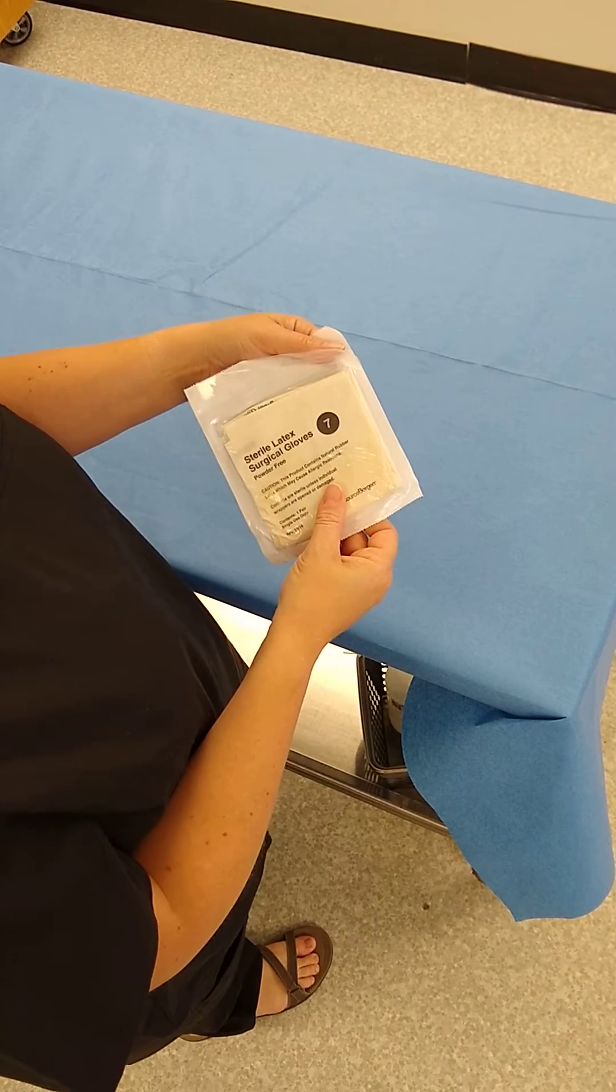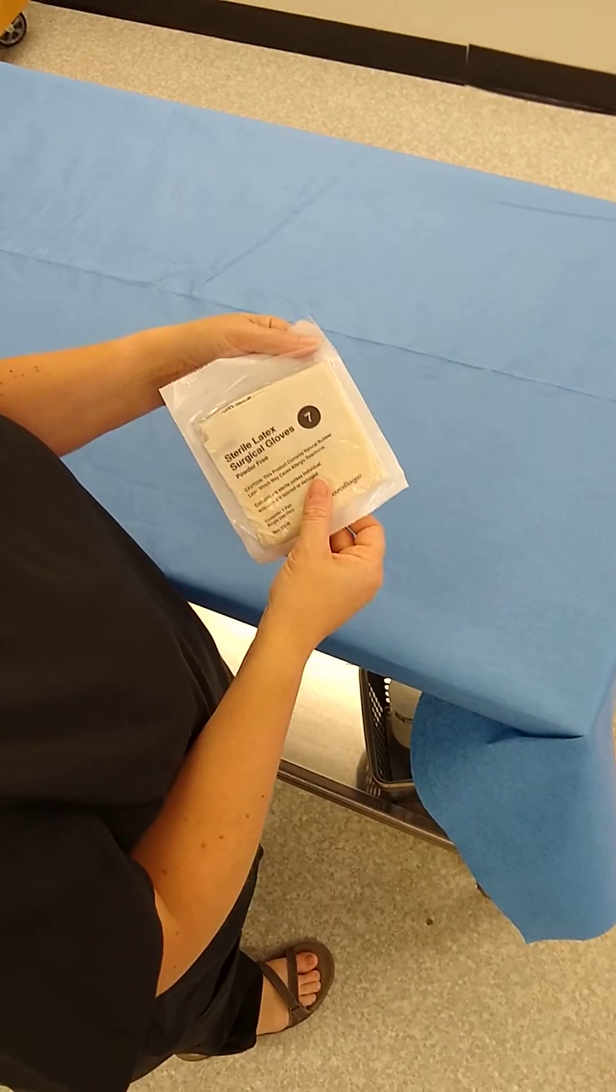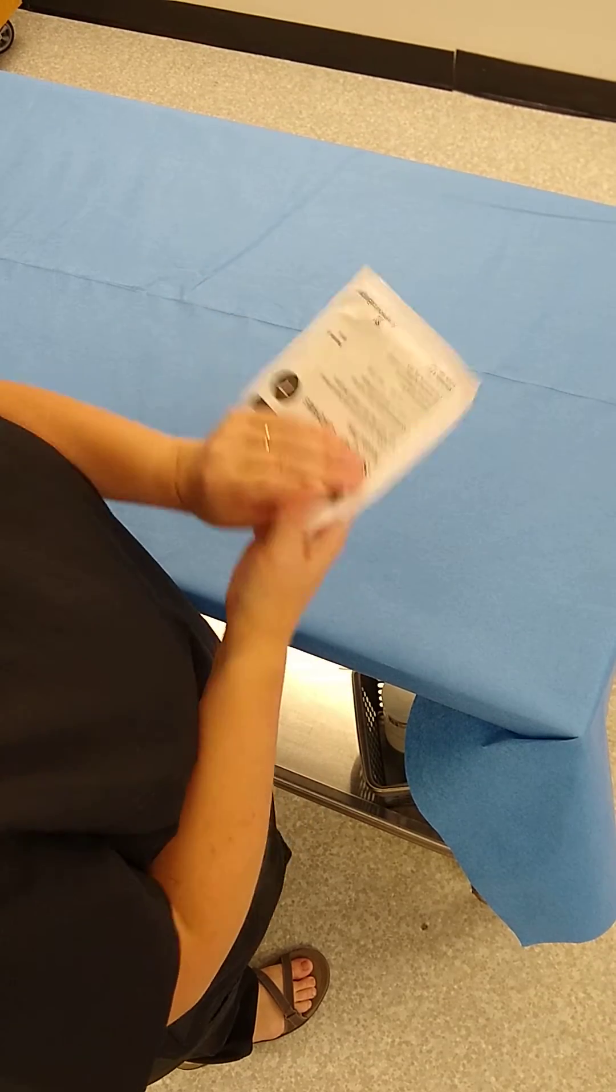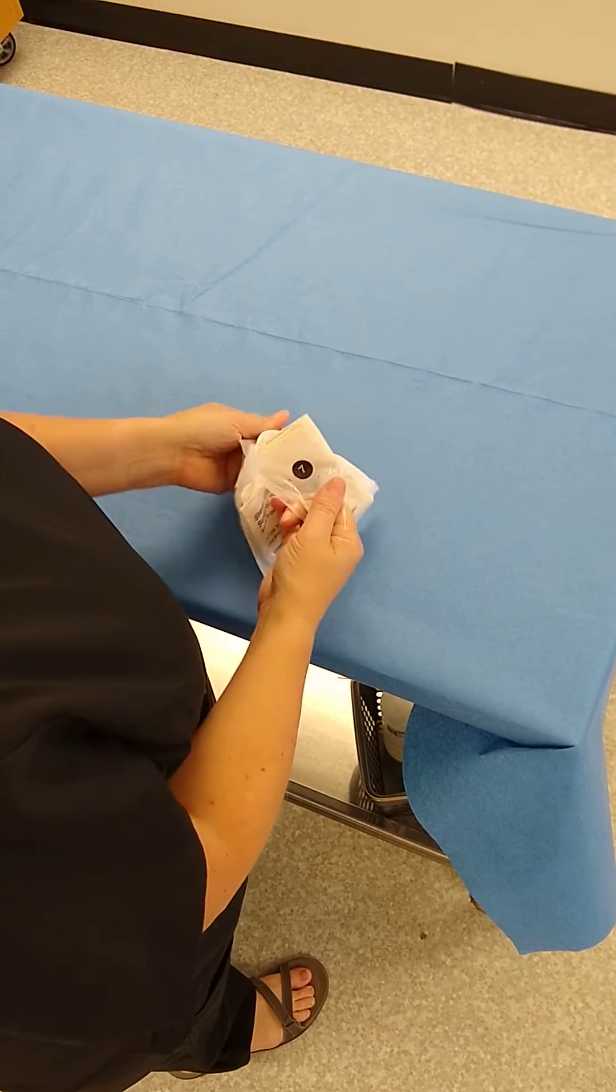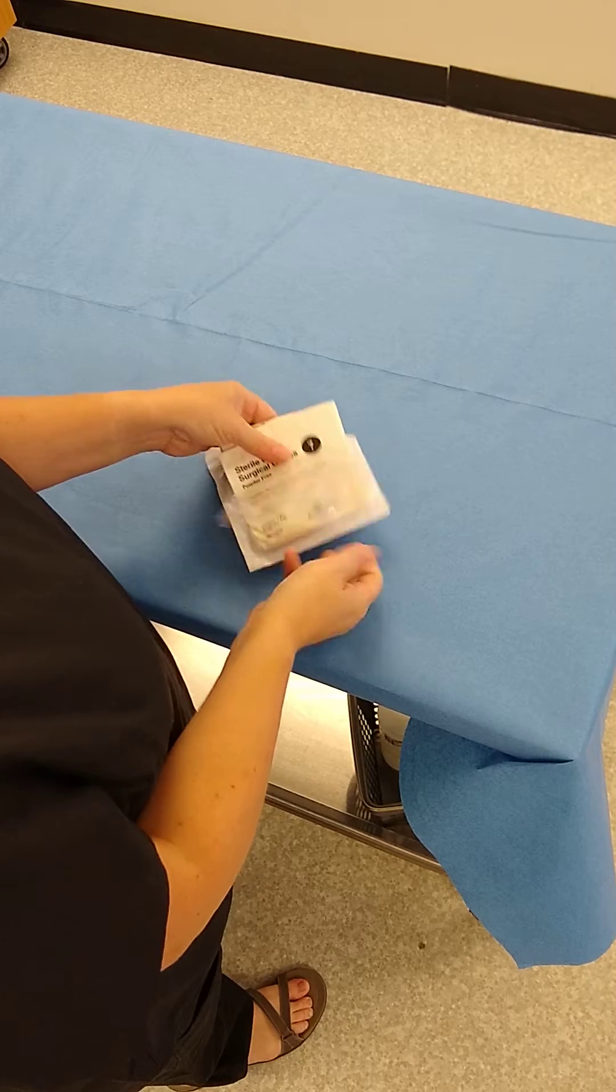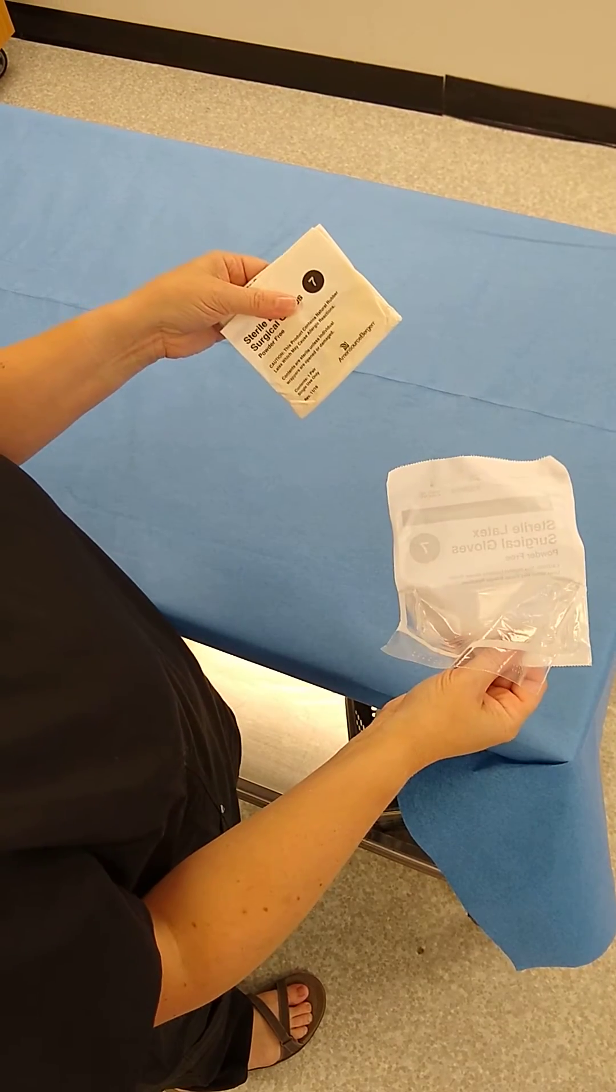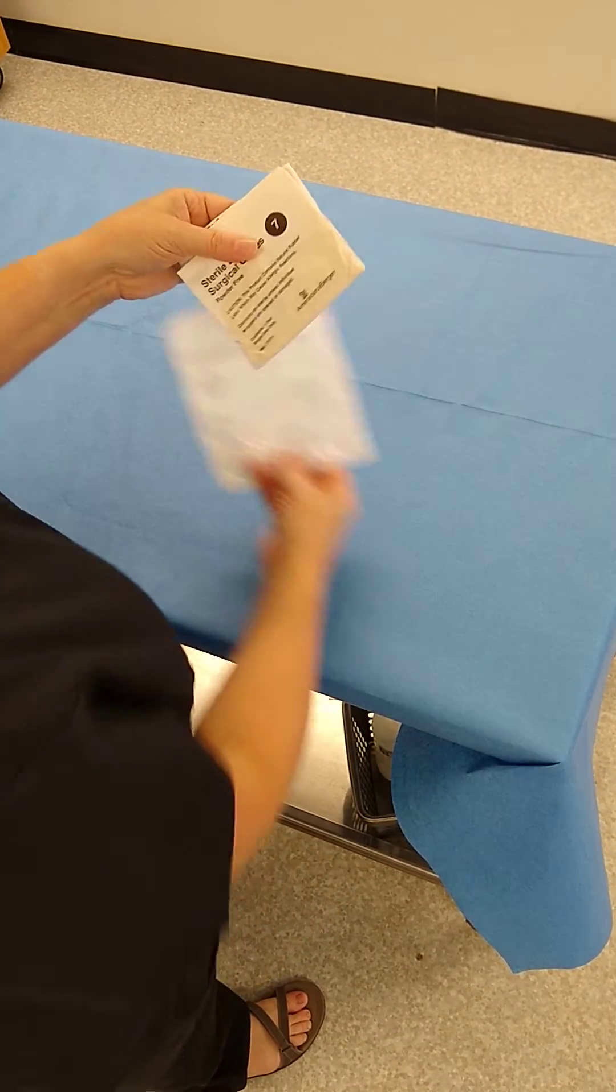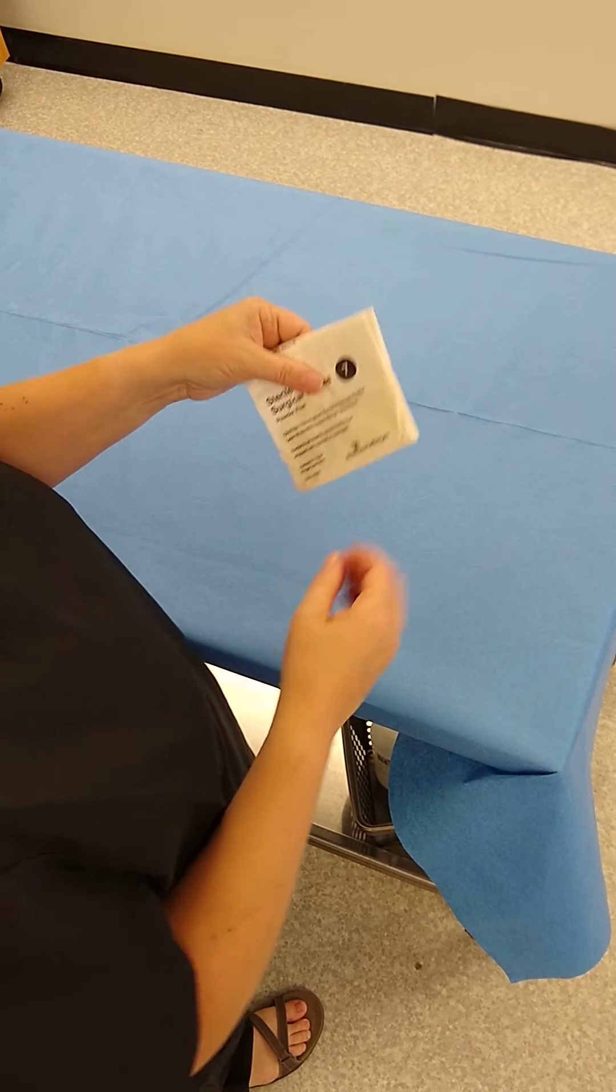Okay, we're going to demonstrate how to do an open gloving procedure. First, get your package of gloves and peel this part off. I'm not worried about contamination at this point as long as I keep them in my hands. If you drop this on the ground, you have to start over.